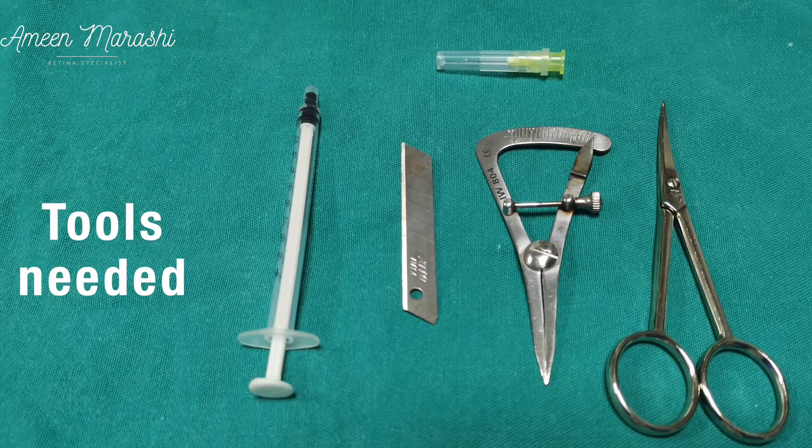The tools needed are scissors, calipers, blade, luer slip syringe, and a 30 gauge needle.